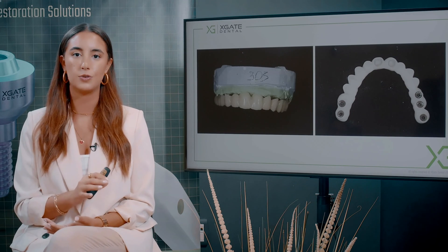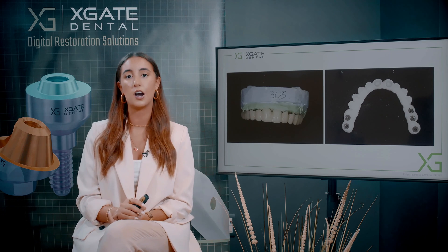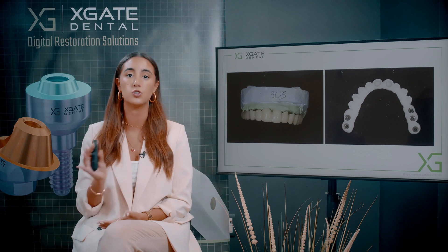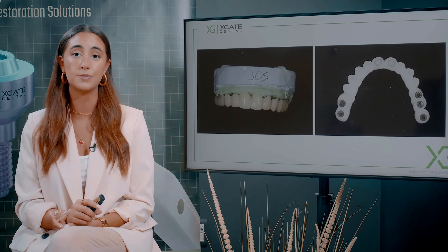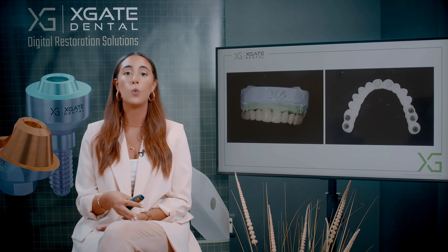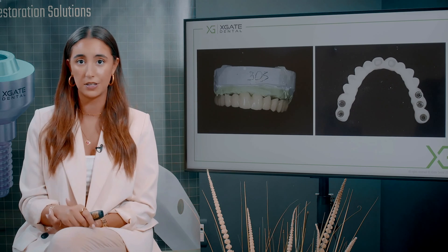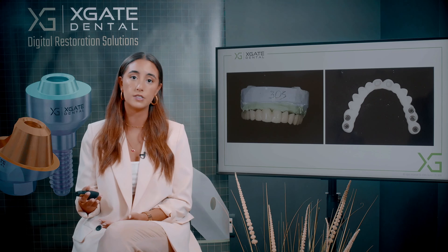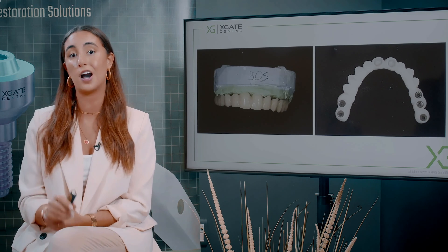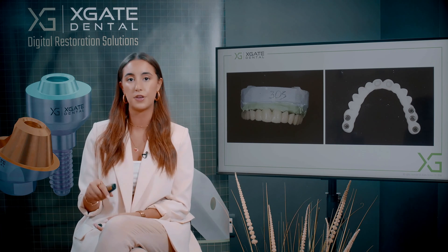You can see here the two teeth, three implants, two implants — and this was made on a gypsum model produced with CAD/CAM. All the designing and milling was done on the computer, but the scanning and impression part was traditional. You don't need an intraoral scanner to make this type of work. Sometimes it's even easier because you don't need to manage all the liquids, blood, and saliva in the mouth during intraoral scanning. You just use your silicone and transfers, take impressions, and it works perfectly. Almost every laboratory today has a desktop scanner, and it's good enough for everything you need.